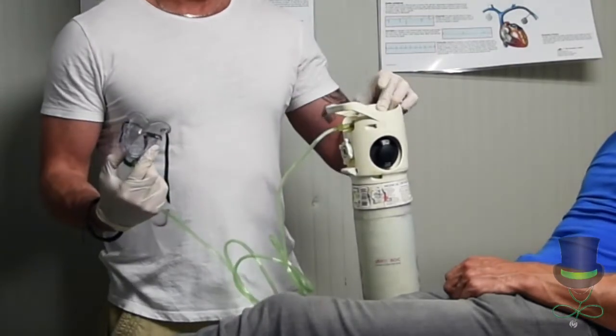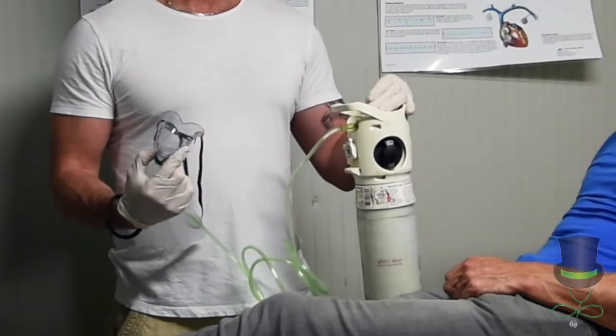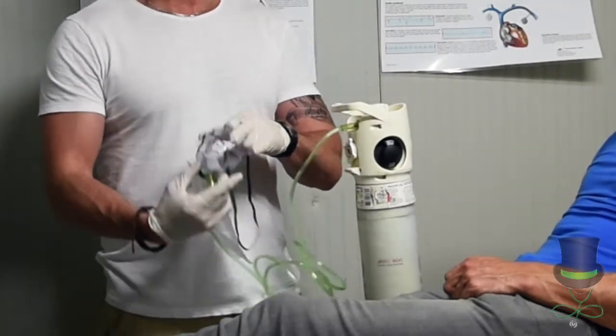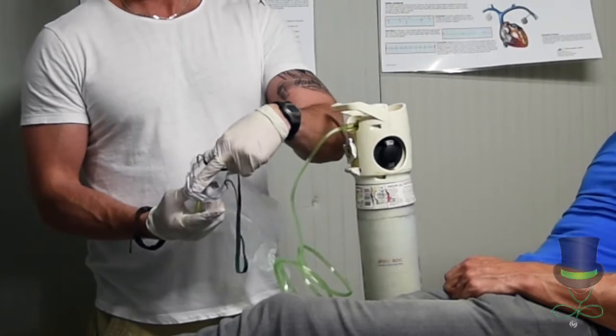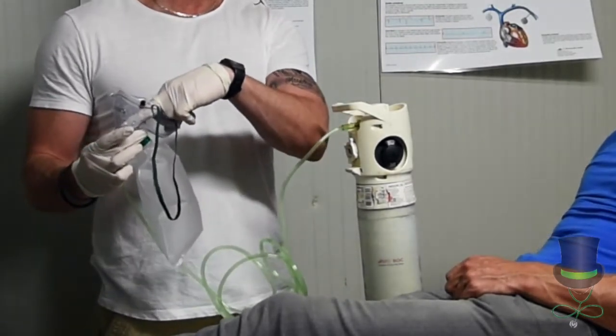Ensuring you have a gloved hand on, turn on the oxygen to fill the bag and place a finger over the hole, ensuring that the bag is full before applying it to the patient.